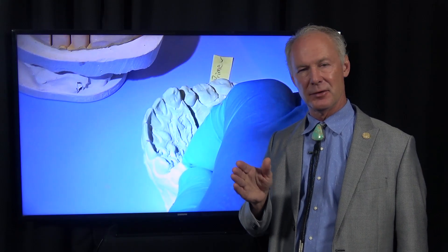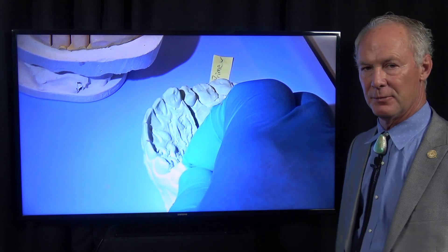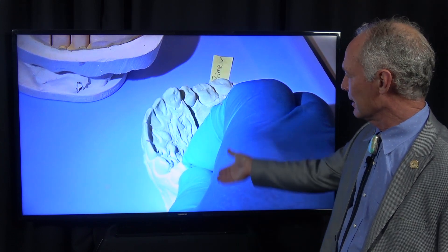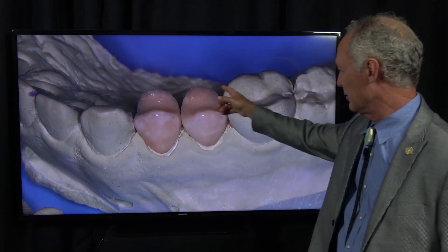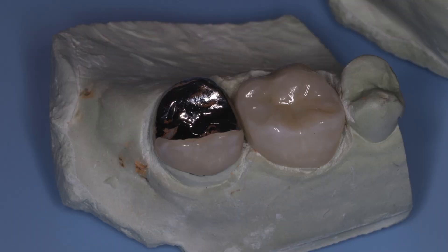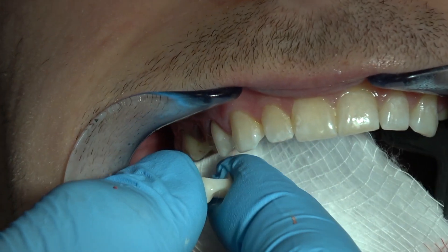That video shows you what to do if that ever happens. But the best thing is an ounce of prevention is worth a pound of cure — just get it right. Take a little time, use the solid model. These are perfect on the solid model, and at most you might have to just dust one every now and then. But normally there's no interproximal adjustment whatsoever. Perfect contacts — they just drop to place. Ideal interproximal contacts.